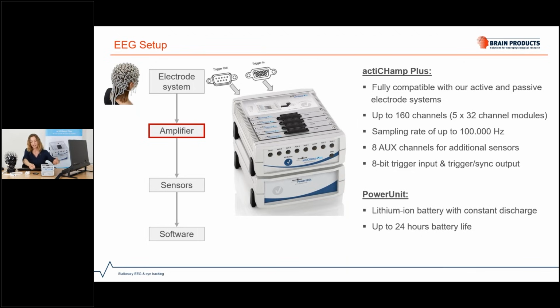And lastly, here underneath the amplifier, we see the battery that is used. This is the power unit. This is lithium-ion based and has a very constant and reliable discharge. And when it's fully charged, you can record up to 24 hours with it.